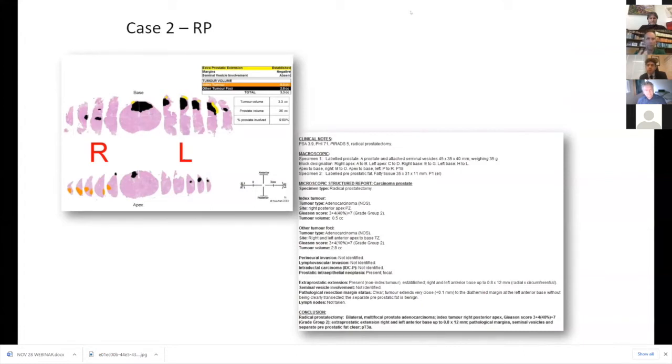I think this is just really illustrative that if we are considering focal therapy, and I'm running a focal brachytherapy prospective registry here in Melbourne at the moment, so obviously very interested in this space, it does show you that you've got to be pretty confident that you're not missing significant cancer elsewhere in the prostate if you're just targeting one lesion. And that obviously speaks to having expert MRI reporting, but it also probably mandates, I think, some template biopsies as well.